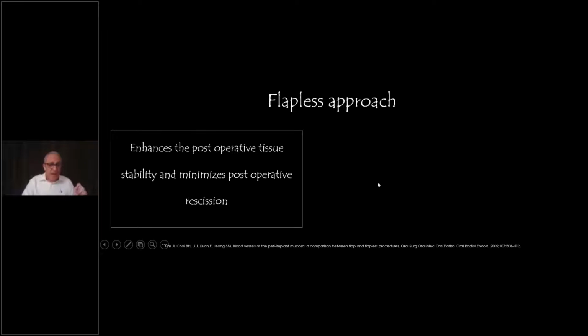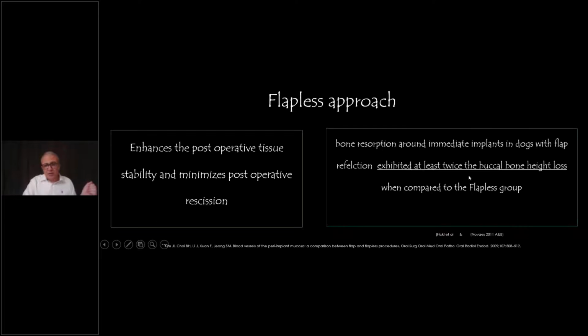Flapless, yes. I believe that a flapless approach is the unique approach, and you will see Dr. Tarnow covering this very nicely. It enhances the post-operative tissue stability, minimizing post-operative recession. Bone resorption around immediate implants in dogs with flap reflection exhibited at least twice the buccal bone height loss when compared to the flapless group. That's something that is important as well.